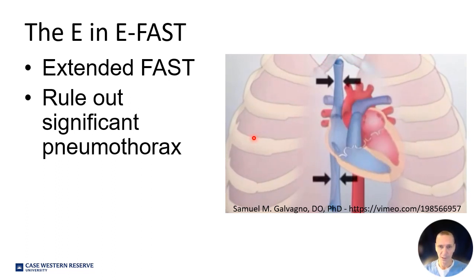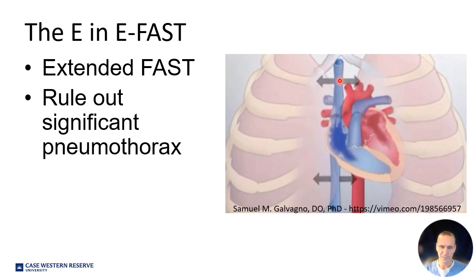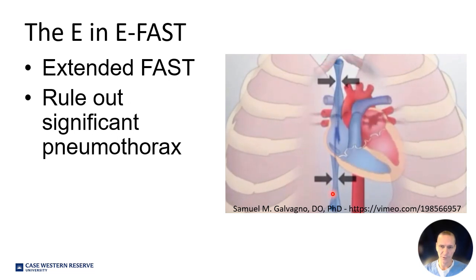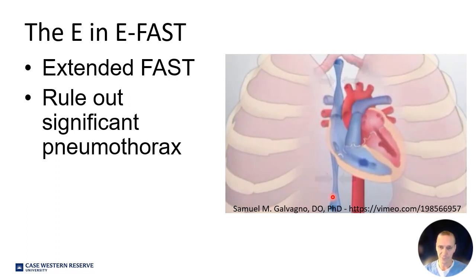Especially with tension pneumothorax, which I'll show images in a second, this positive pressure reducing preload is even more dramatic on a patient who is volume depleted or in the setting of trauma who may be bleeding.